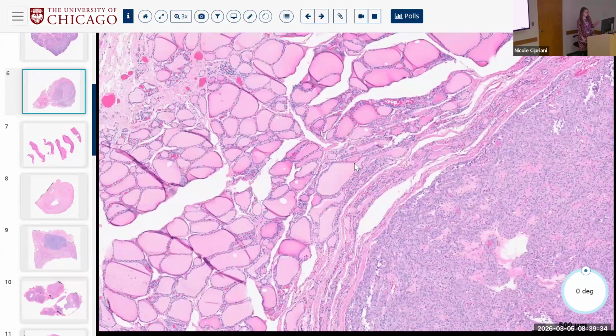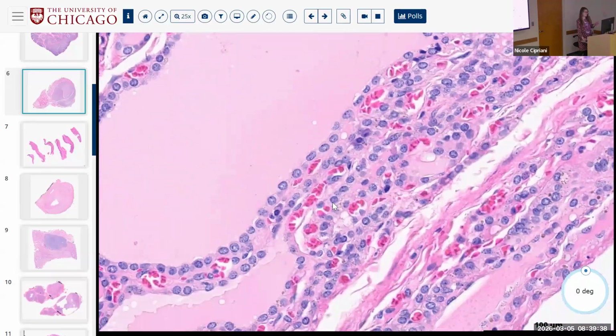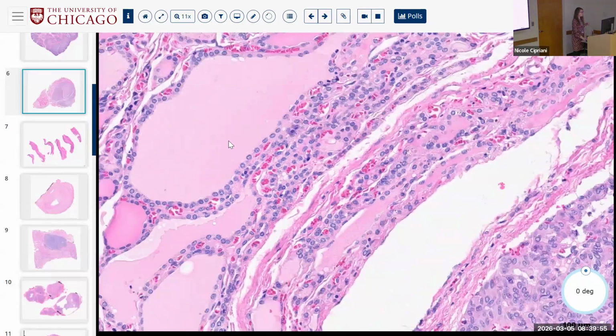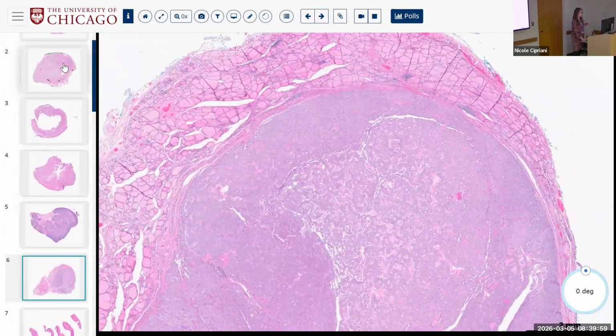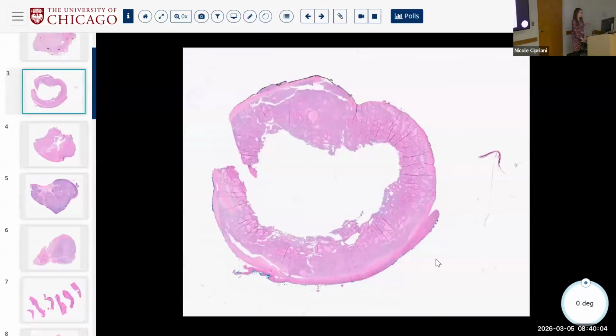But one of the things to always look for in the background, right, is, do the background nuclei also look unusual? Because in some cases, right, it could be processing artifact. And if your nuclei in the background are equally as cleared as your nuclei in the tumor, then, you know, you can't really use that as an indicator. Does that make sense? So we haven't really done that yet, but we could go back, right, and say, all right, in this, oh, this was the oncocytic one, so probably not going to help us.